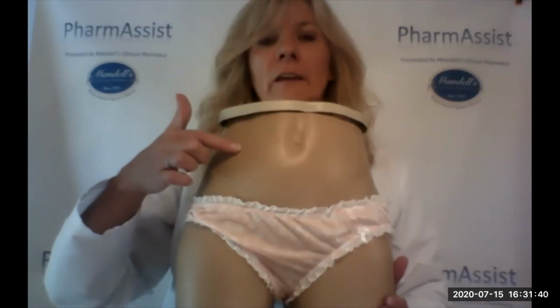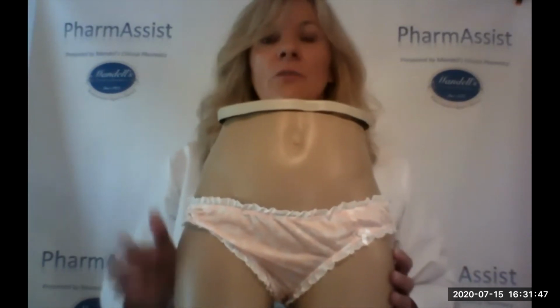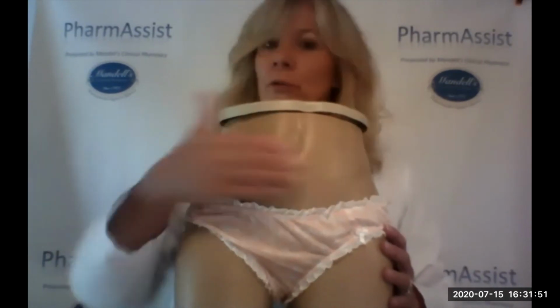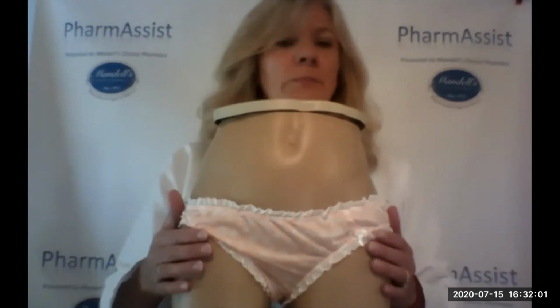And you would move this around for each multi-dose injection you would take. This area here, you move the injection around in the top thigh or even in the side outer thigh. So I always get asked a question of, if I use my belly, do I have to stick with my belly? No, you can use belly and add in the thighs. You could do just thigh and no belly, or you could do a combination. And whichever way you choose to do that is perfectly fine.